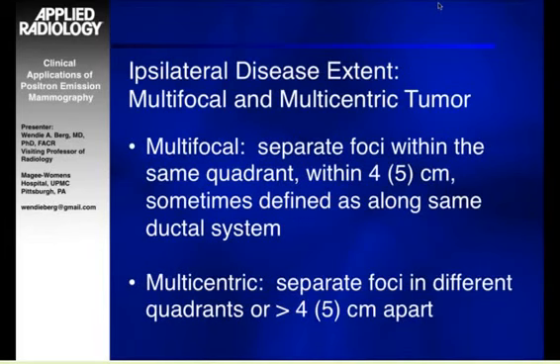Multicentric disease is usually defined as separate foci in different quadrants or at least 4 or 5 centimeters apart. And usually patients with multicentric disease historically would be treated with mastectomy.